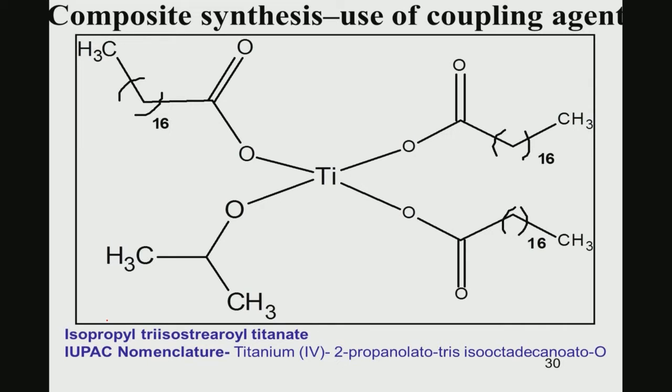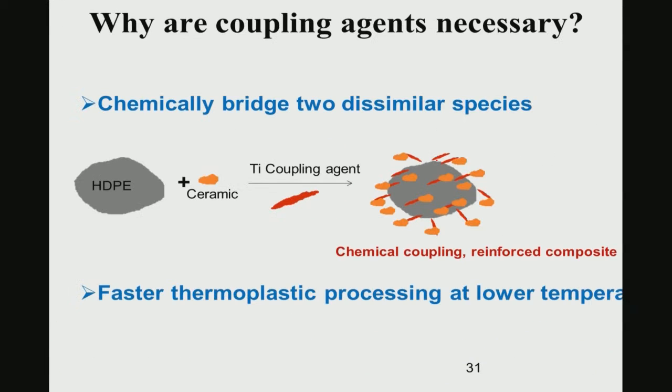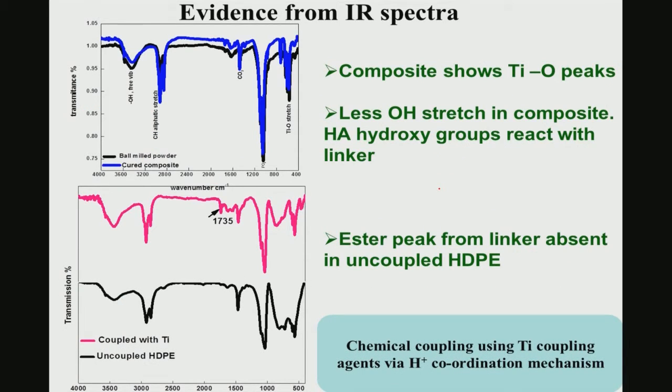Earlier I mentioned that a coupling agent needs to be used, and one of the coupling agents that we have used is a titanate based coupling agent with this particular formulation. What you see is titanium in the center, and all this chemical composition is very characteristic of this coupling agent. A coupling agent is necessary to chemically bridge two dissimilar species, that is, chemically different. Here you have a titanium coupling agent, high density polyethylene, and a ceramic, and you get chemical coupling, that means a reinforced composite, and therefore faster thermoplastic processing can be accomplished.